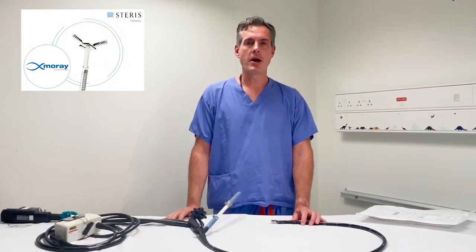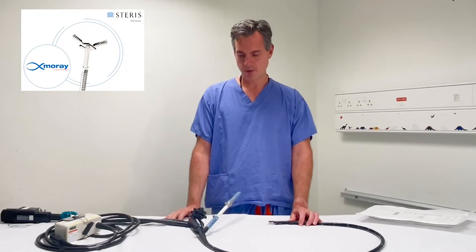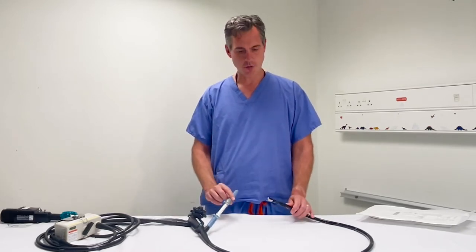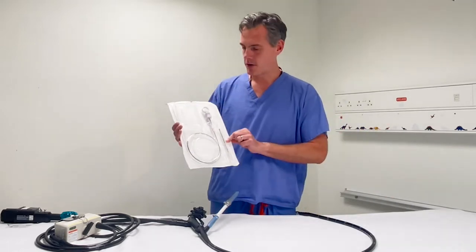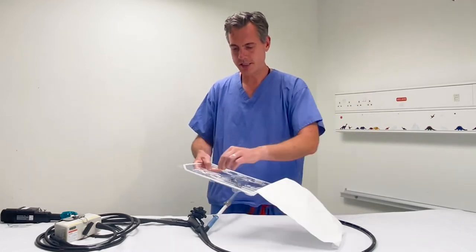I'm going to demonstrate the use of the Moray micro forceps. This is a device whereby the forceps have been miniaturised such that they fit down the channel of a 19-gauge standard EUS cytology needle. Here we have the scope set up — I've already got a 19-gauge needle down the scope, I've taken the stilette out, and this is how the Moray micro forceps arrive. We have our assistant take them out.